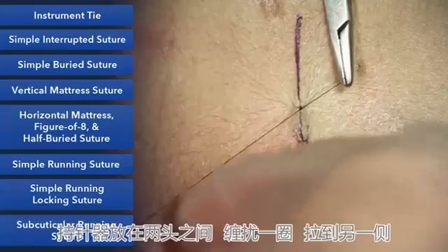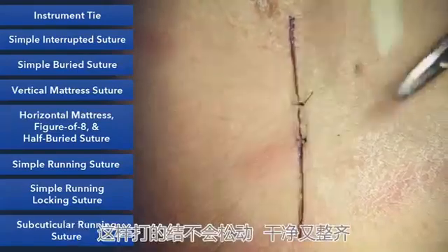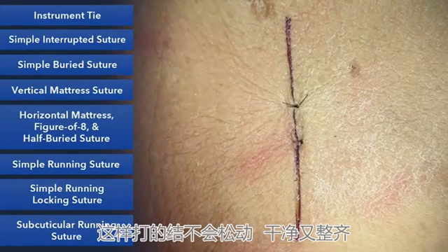Needle driver between the two, wrap once, pull to the opposite side, and keep that knot nice and square. Square knots will not untie. Also will look cosmetically more appealing.